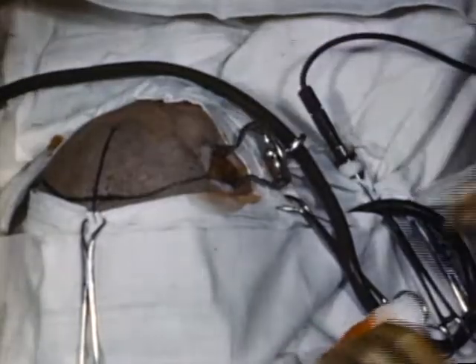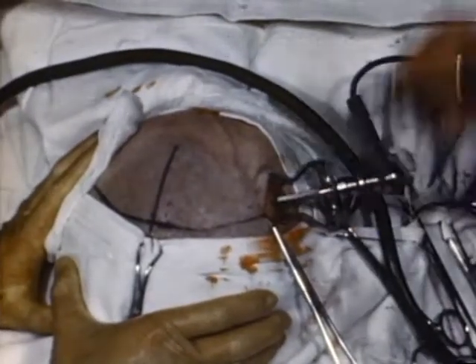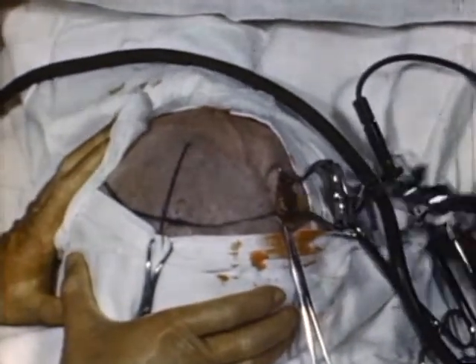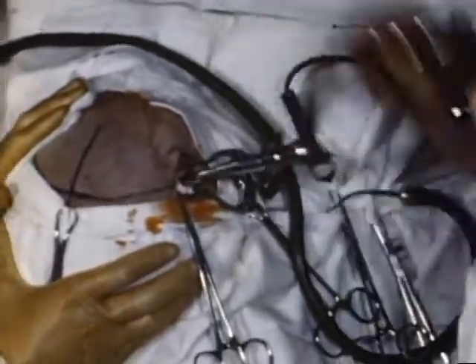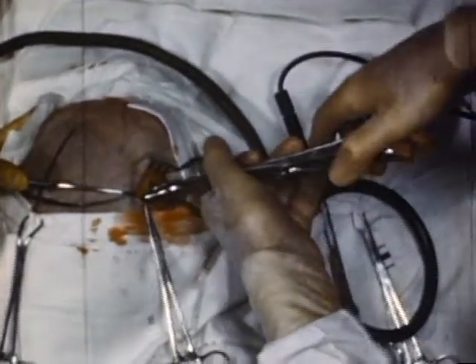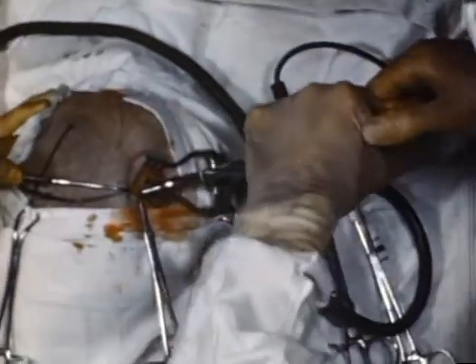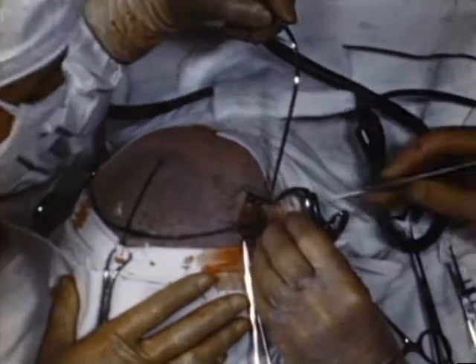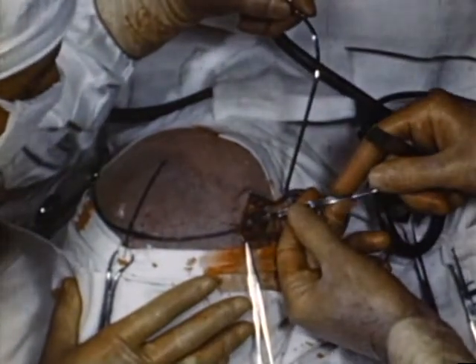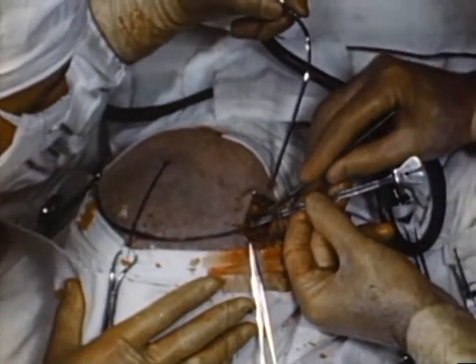A burr hole is placed in the coronal suture by means of successive drills. The opening is then enlarged in the line of the coronal suture by a rongeur to give greater play for the knife. The dura is opened and the cortex is punctured in an avascular area, following which the leucotome and the nasal septum periosteal elevator are introduced.